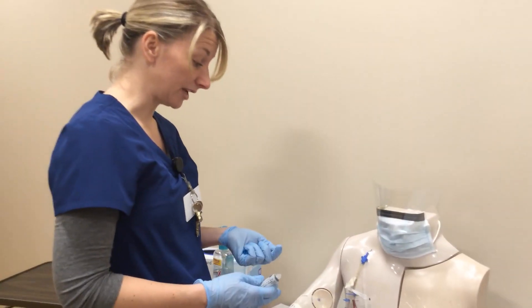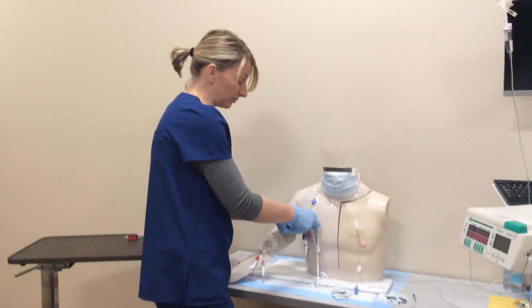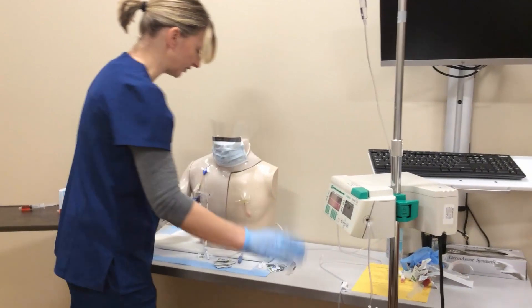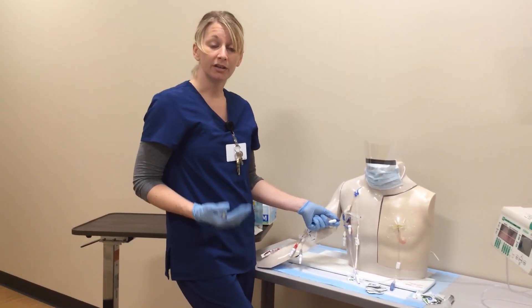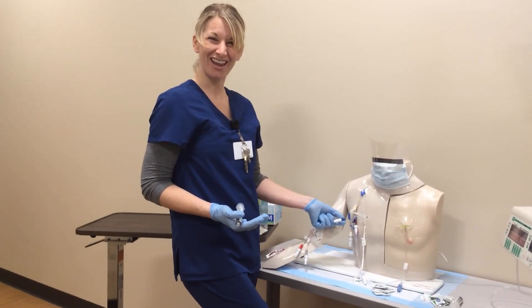Since I clamped my other lines, I need to go ahead and open the other line back up to resume whatever was infusing. That would be how you draw blood from a central line that does not have an IV running.